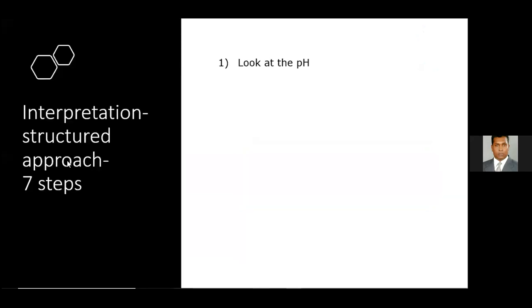Right. So interpretation of blood gas, like in any other critical care approach, has a structured approach. If you look at different books and different lectures, different people may be saying different steps, but this is how I usually teach. So I usually advocate 7 steps.